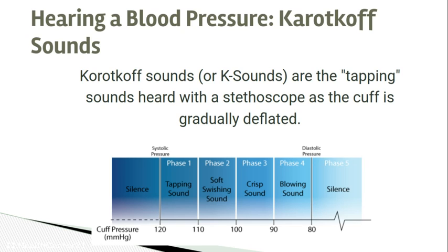And so it kind of goes in different phases. There's about 5 different phases that you hear, and you can see them detailed out. But if I'm being totally honest, I think it starts really strong and then it gradually just gets fainter and fainter as you release the cuff.